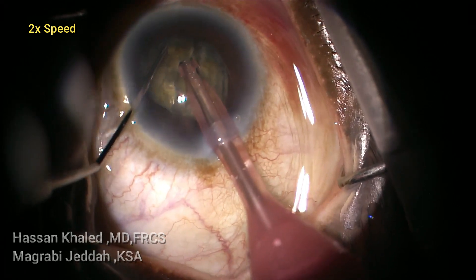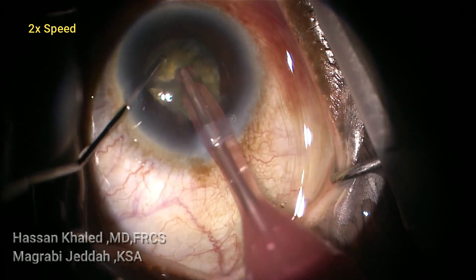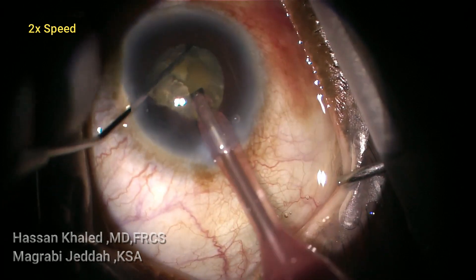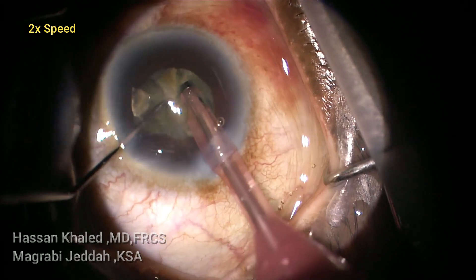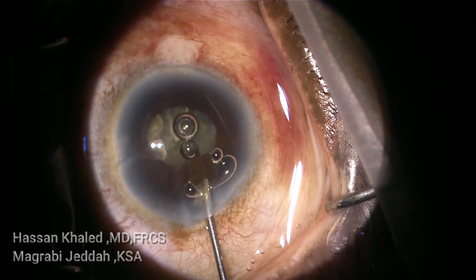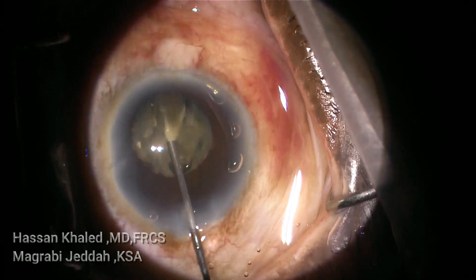At this point, you can see the floating of the iris and how the pupil starts to constrict. The cataract is chopped into smaller pieces, but the posterior plate wasn't chopped very well.